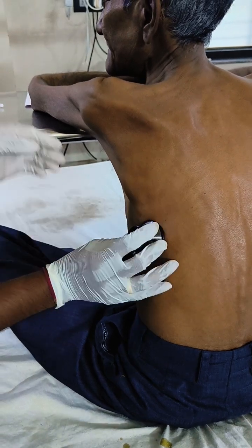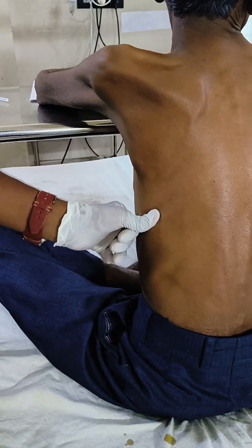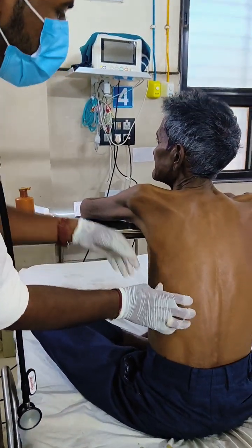We will auscultate for the same. We are auscultating now. There is no air entry, so air entry is reduced now. So this is the point where you have to prick.